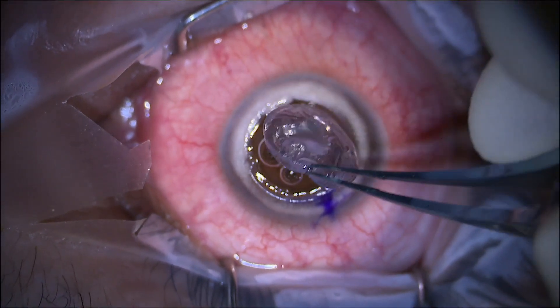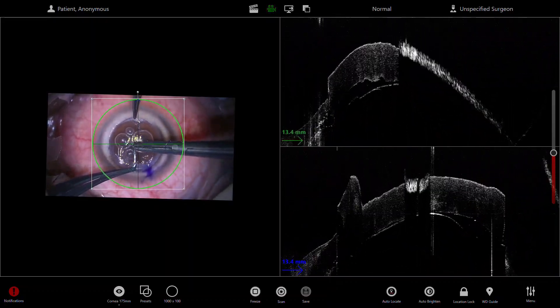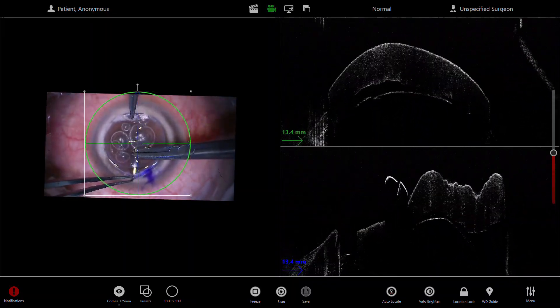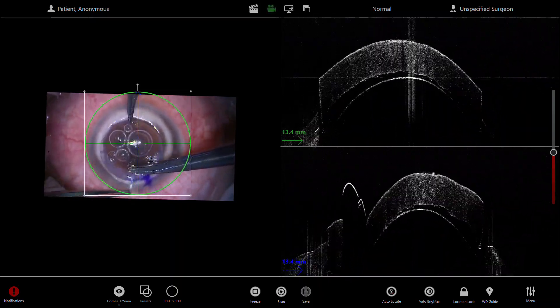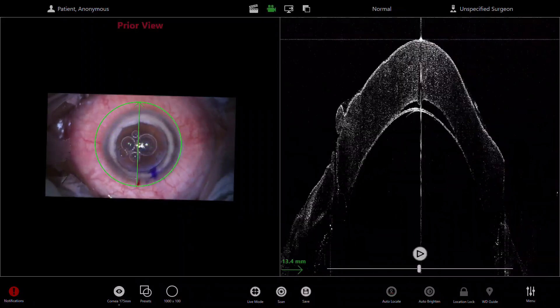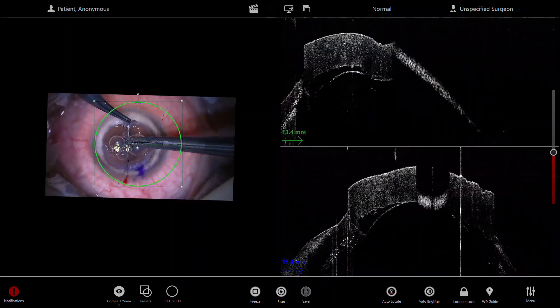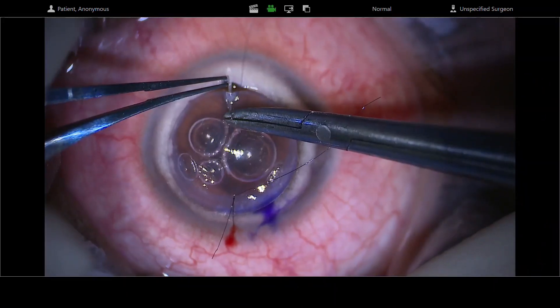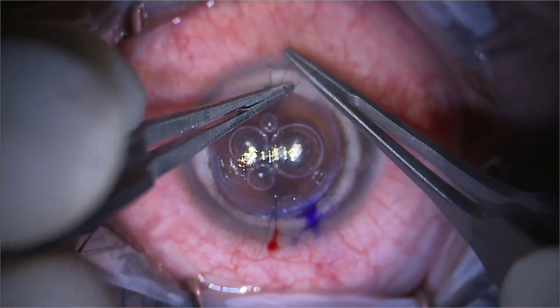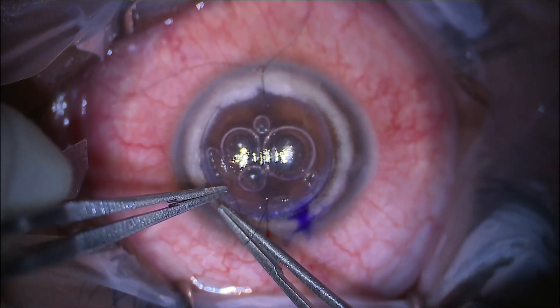Here I'm very carefully placing the donor material onto the surface of the big-bubbled host. Now I'm carefully placing the cardinal sutures — you can see that I'm getting the assistant to hold the opposite end to maximise accuracy. You need to be very careful not to go too deep with your sutures as you may perforate the Descemet's membrane. A useful point: despite having OCT guidance, you can still see the bubbles in the anterior chamber, which gives a good idea if the Descemet's membrane is still intact. It's important not to get any perforations at this stage — if not recognised, you'll end up with a double AC.